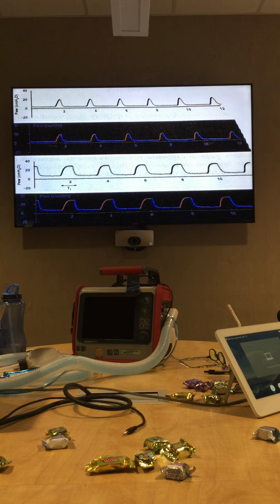So the other thing that I can increase in that curve is time, whether it's on the inspiratory side or expiratory side. So if I increase my inspiratory time, so if I say, okay, I'm at 0.3, right? Now all of a sudden I take it to 0.5. Well, did I give that lung longer at that set pressure? I did. So that pressure is going to stay in the lung for a longer period of time. So I'm going to increase my mean airway pressure by doing so.